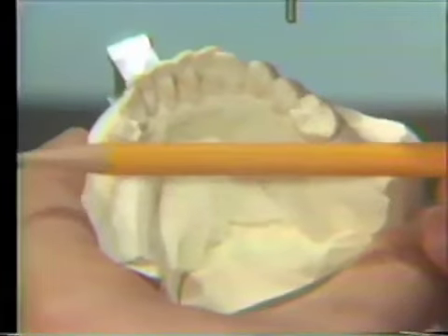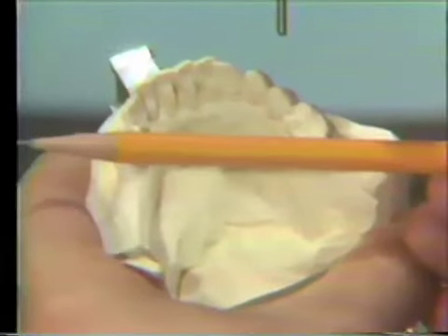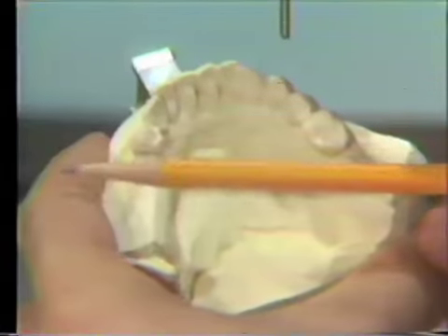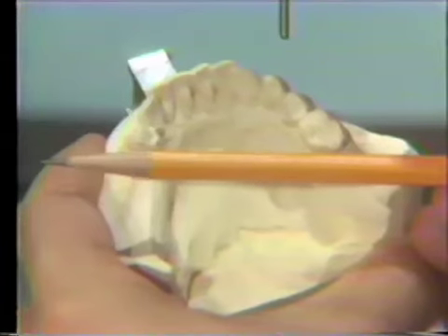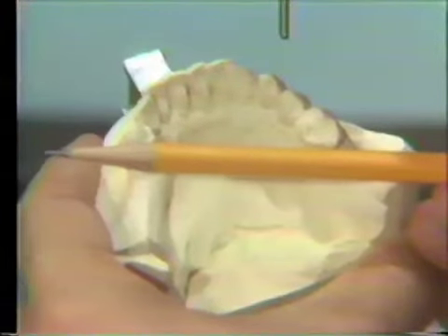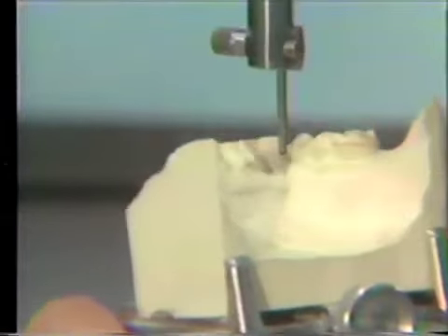Now the line that is the most perpendicular to that and the furthest forward that would provide a positive rest seat is this bicuspid-cuspid area. And the mesial fossa of that tooth is a natural recipient for an indirect retainer. So as I look at this, when I am surveying it, I'm keeping in mind that that's the probable position of an indirect retainer. So I'll mark the height of contour also on that tooth.